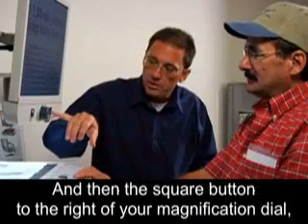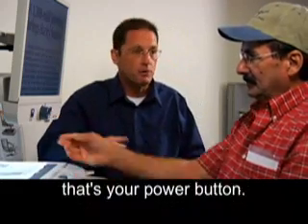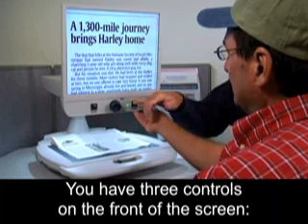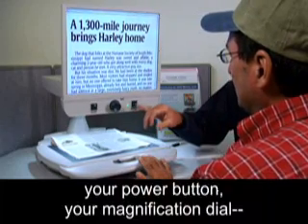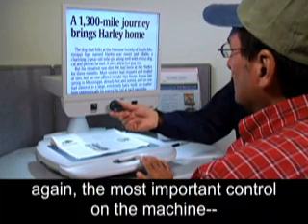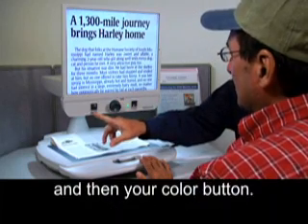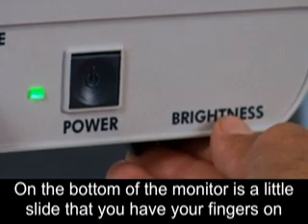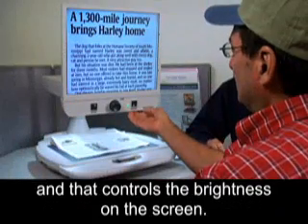The square button to the right of your magnification dial is your power button. So it's very simple — you have three controls on the front of the screen: your power button, your magnification dial (the most important control on the machine), and your color button. On the bottom of the monitor is a little slide that you have your fingers on, and that controls the brightness on the screen.